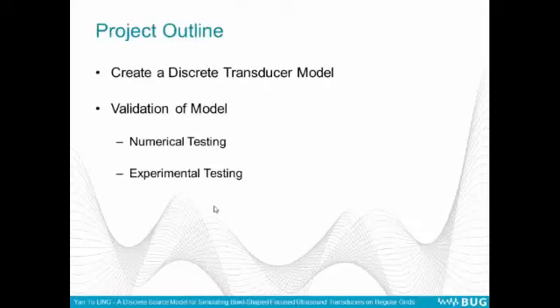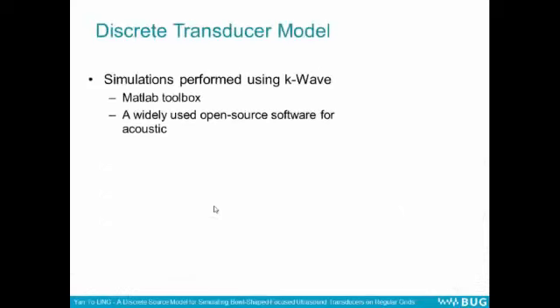This is our project outline. We created a discrete transducer model, and we validated the model against numerical testing and experimental testing. For the discrete transducer model, all the simulations in this project were carried out with the MATLAB toolbox k-Wave. It is a widely used open source software for acoustics.